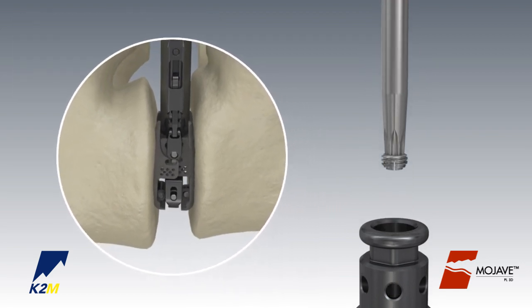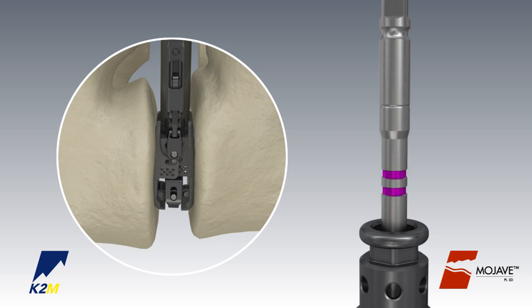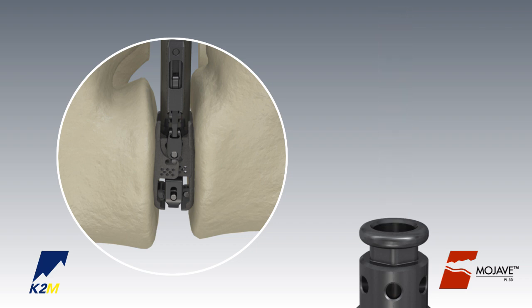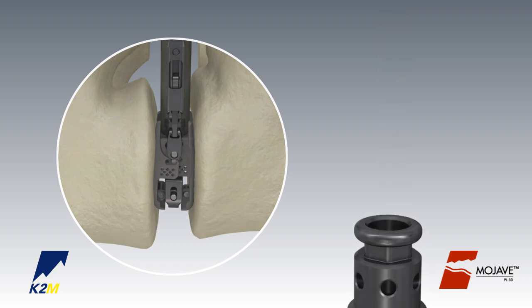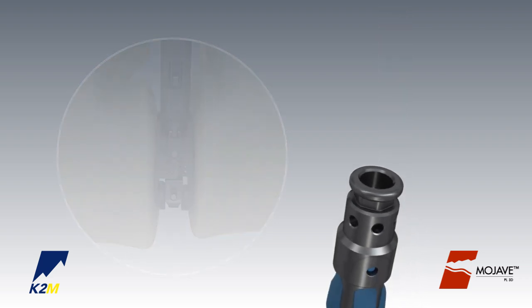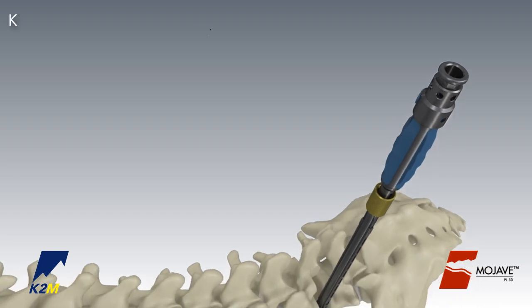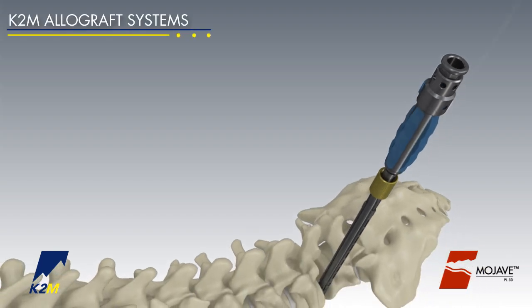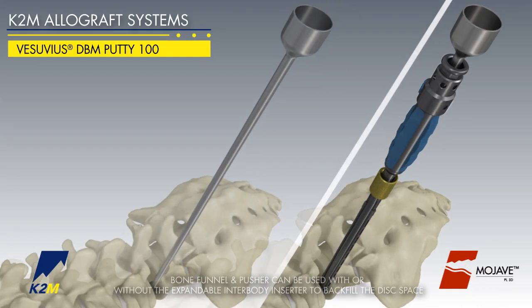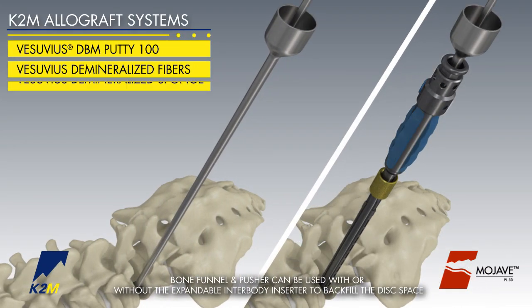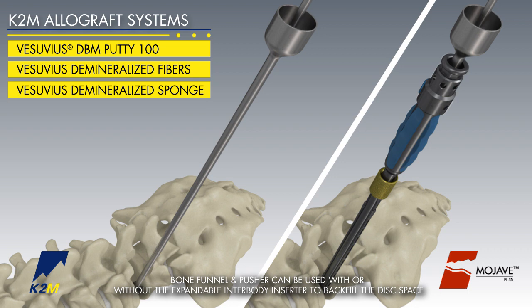Application of a locking screw is required to lock the implant in its expanded state. Once the implant has achieved the desired fit within the disc space, a bone graft funnel is available to pack additional autograft, allograft, or both into the interbody.